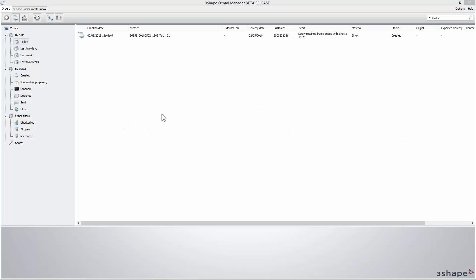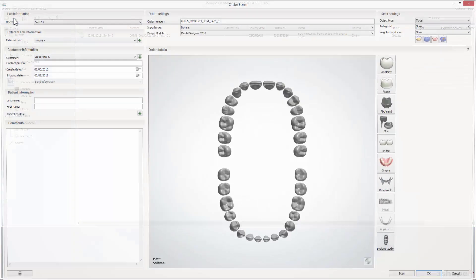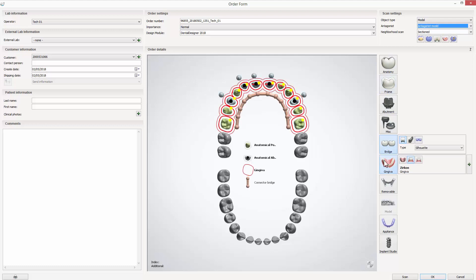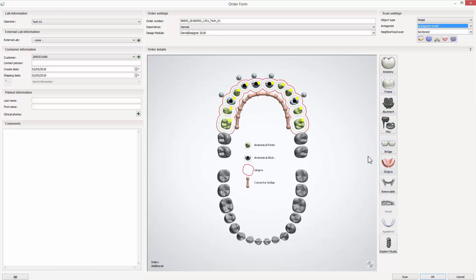Start by opening the Dental System Manager and creating a new order. In the order form you can find the additional scan button. When clicked, the button opens a dialog window that allows the adding of scans to the case.